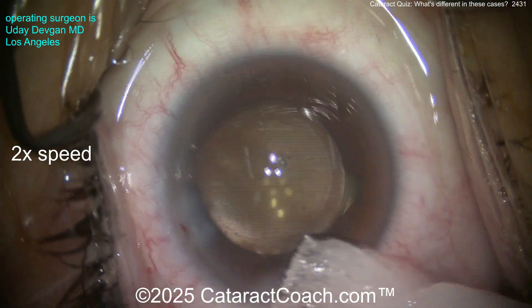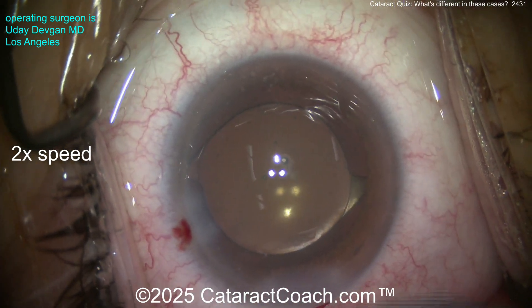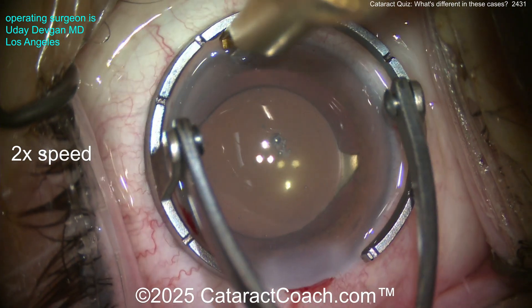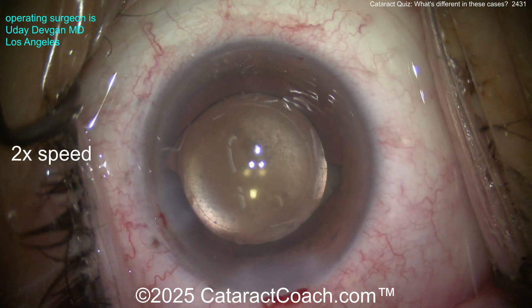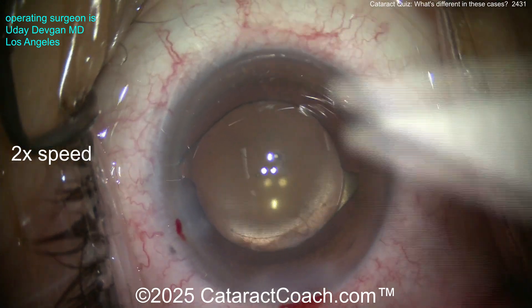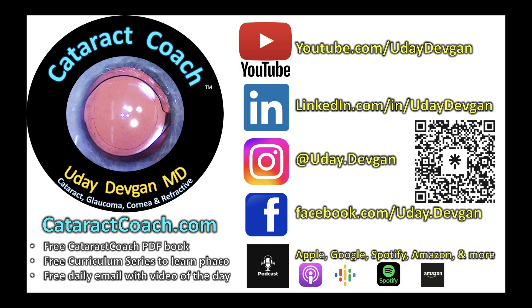We'll put a small aliquot of antibiotic in the eye as well. Using a Weck-Cel sponge with tetracaine, and a little limbal relaxing incision to clean up about a half diopter of astigmatism — don't need to leave that untreated, let's give the patient the best possible vision. I hope you got the quiz correct! Check out the CataractCoach podcast everywhere you find podcast services — listen to one episode and you'll be addicted.